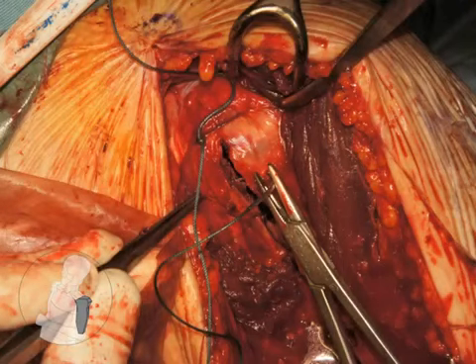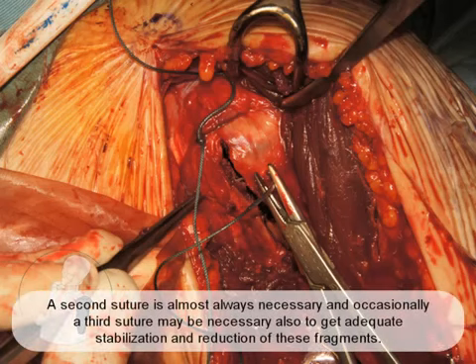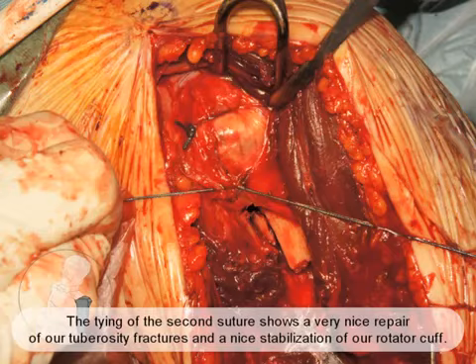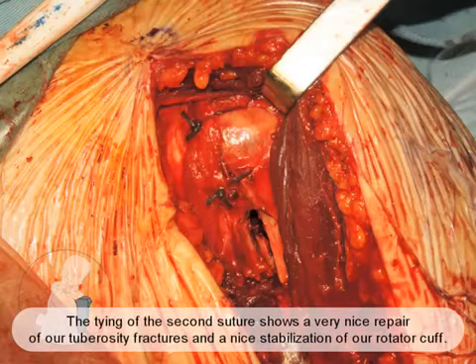Suture is finally tied, and here we see passing a second suture. Second suture is almost always necessary, and occasionally a third suture may be necessary also to get adequate stabilization and reduction of these fragments. And the tying down of the second suture shows a very nice repair of our tuberosity fractures and a nice stabilization of our rotator cuff.